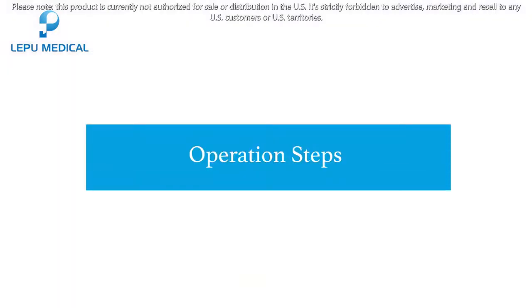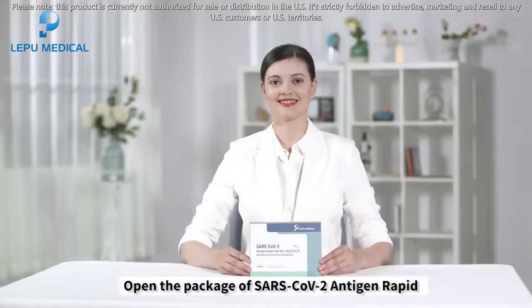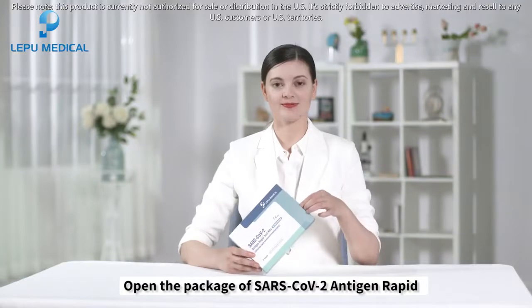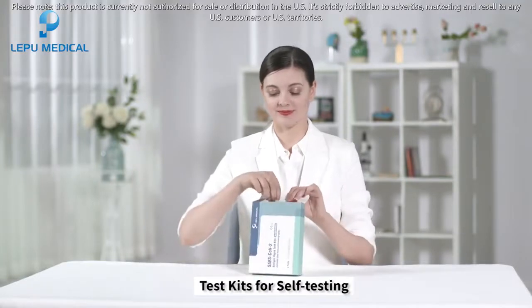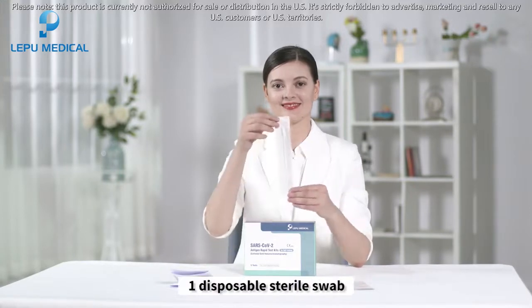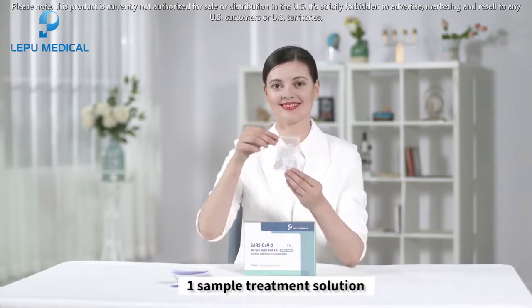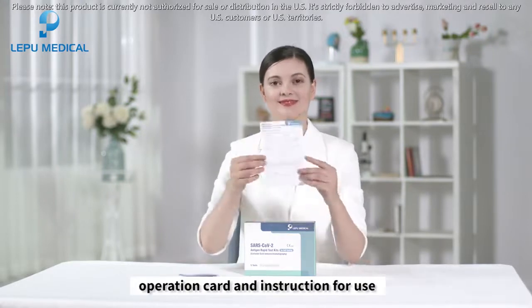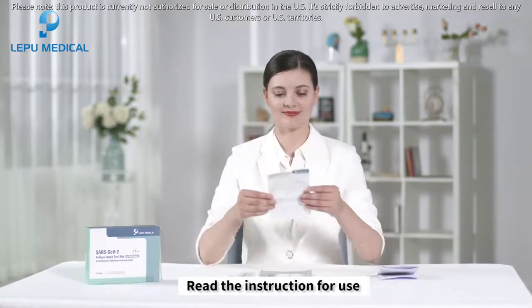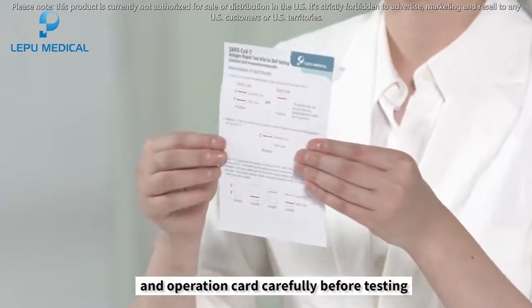Operation steps. Before the test, wash and dry hands. Open the package of SARS-CoV-2 antigen rapid test kits for self-testing. Take one test card, one disposable sterile swab, one sample treatment solution, operation card, and instructions for use. Read the instruction for use and operation card carefully before testing.